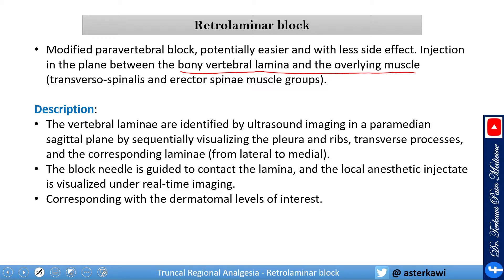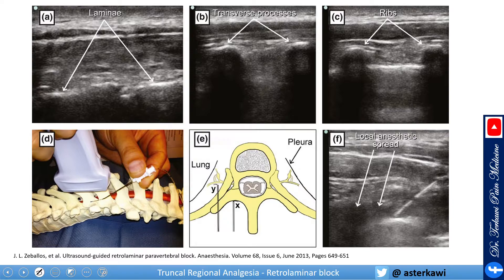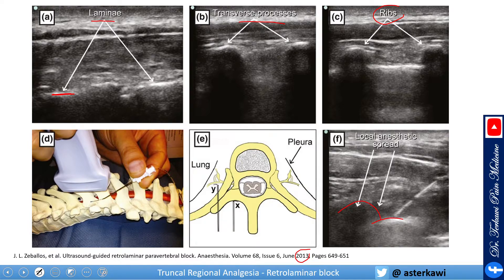Of course, you have to choose the level that corresponds to the dermatome you are interested in. Starting from the right side, which is lateral, you will see the ribs. Then going more medial you start to see the transverse process. Keep going medial and you see the lamina as a straight line. You then inject the local anesthetic and watch the muscles raising up from the lamina. You can also put a catheter there and thread it over the lamina, which is also reported.